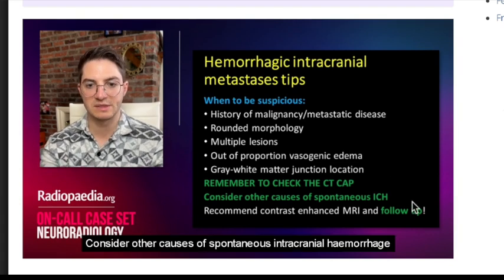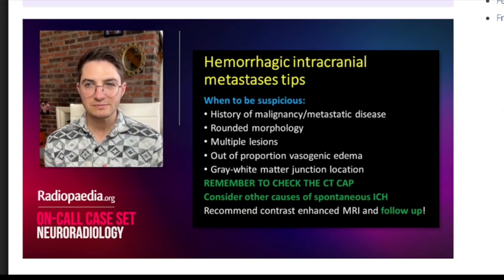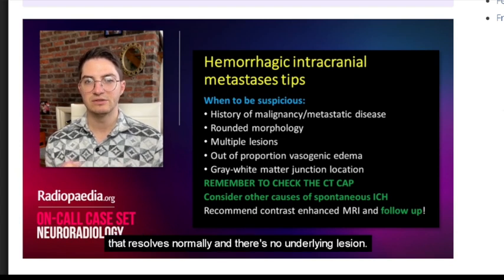Consider other causes of spontaneous intracranial hemorrhage, and recommend a contrast-enhanced MRI and follow-up. The reason you want to get follow-up too is because if you don't see a diagnosis at baseline, sometimes a small lesion could be obscured by a large hematoma, so you should get follow-up, make sure that resolves normally, and there's no underlying lesion.